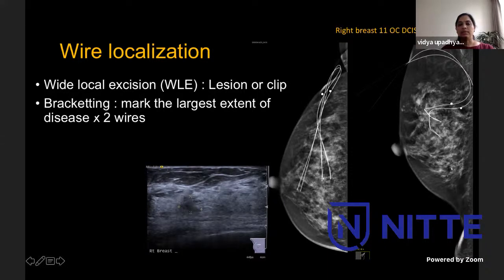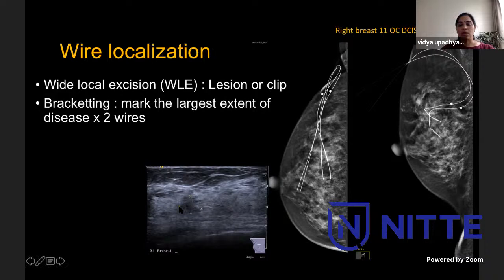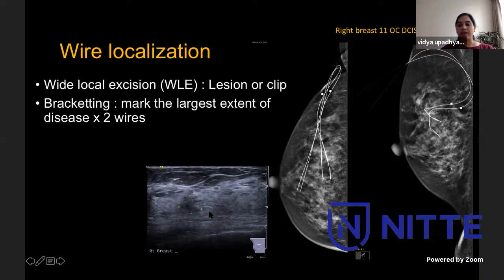Sometimes we bracket the lesion - for example, this case of a very small DCIS. The surgeon wanted to be absolutely certain of getting a non-palpable lesion, so she asked us to put two wires to mark the extent - you can see the two wires and the bracketing of the lesion. Even in multifocal disease or if the patient wants two wide local excisions in different quadrants, we can put two separate wires. These are all done in discussion with the surgeon - as they want, we try to help out.